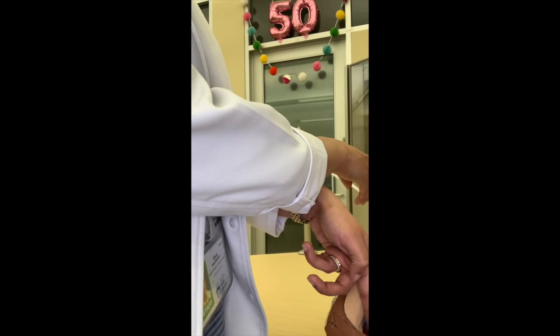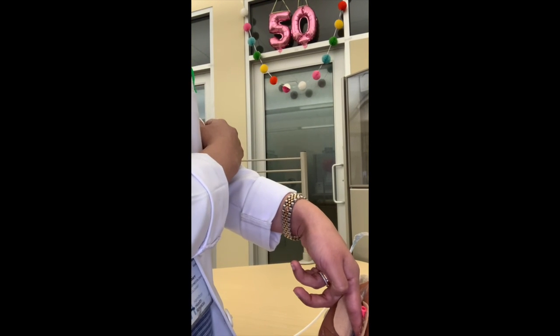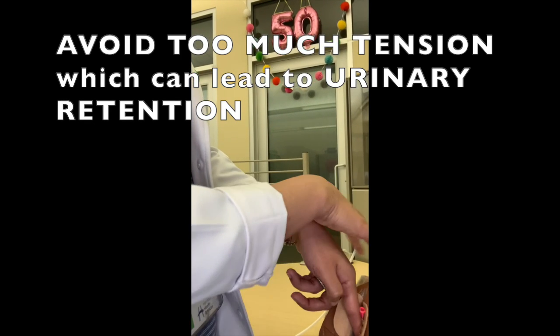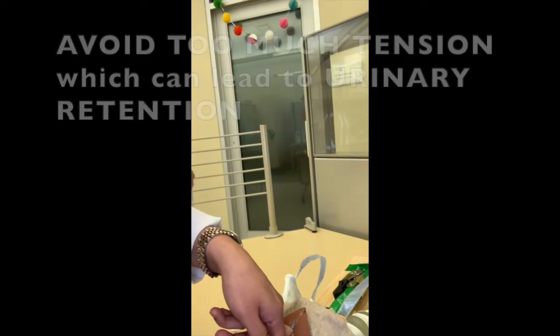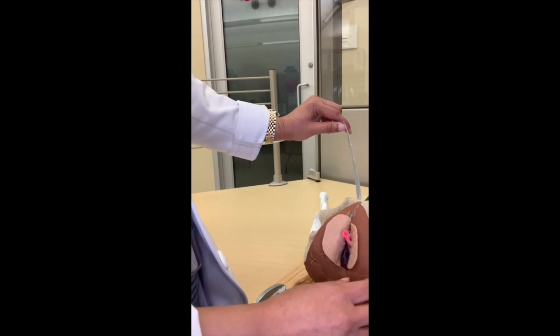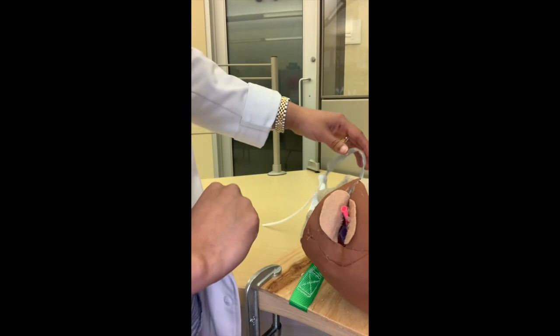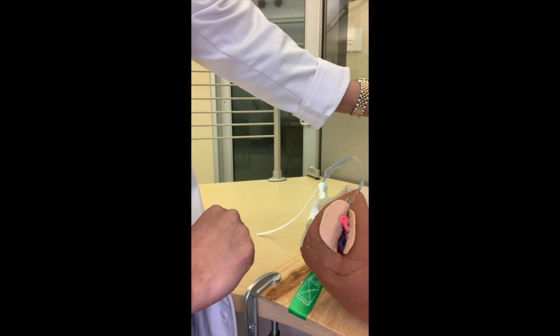you're not tensioning it, because if you do that, it will put the patient in urine retention, and that is not how it works. You're basically just creating a platform to sit under the bladder neck. I'm pulling, and you can see how we leave a bit of space between the urethra and the TVT. Once that is done, you can cut the plastic off.